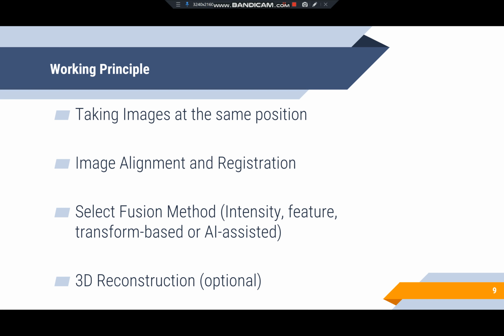The intensity-based fusion refers to combining pixel or voxel values from the corresponding locations in CT and MRI images, where pixel value averaging is involved. However, it combines the images based only on the pixel or voxel intensities. This approach can lead to loss of valuable information, especially when the relationship between the intensity in CT and the MRI is complex and nonlinear.